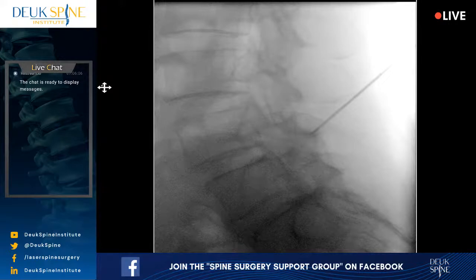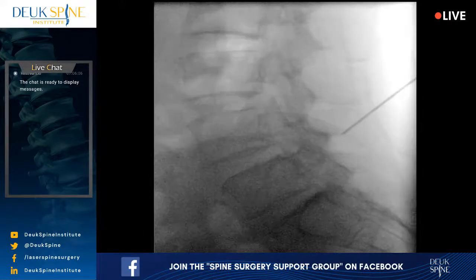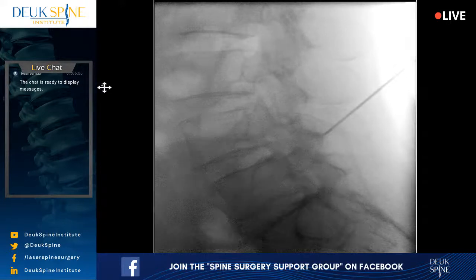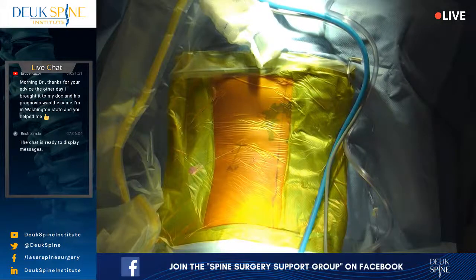So why is it not easy to line the fluoro up with the spine? A little more. You can see the back of the L5 vertebral body has got a double shadow there. I don't know, maybe more? I think that's worse. Yeah, try to go back a little bit. It looks better, but I just feel like it's still not quite there. Give me a degree one way or the other, just a degree. I think you're somewhere between the last position and this position, maybe. Try to go back half a degree. Let's just try that and see what happens. I don't know, Jordan, any ideas? Luis?